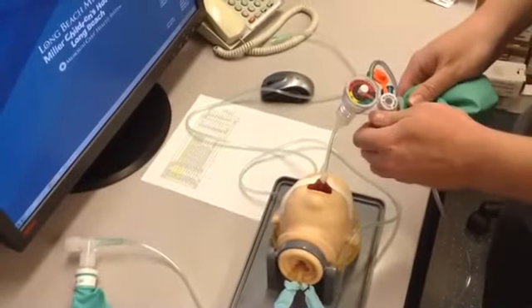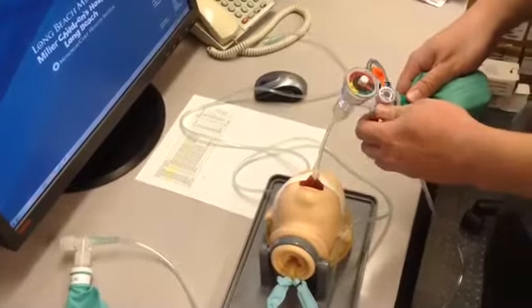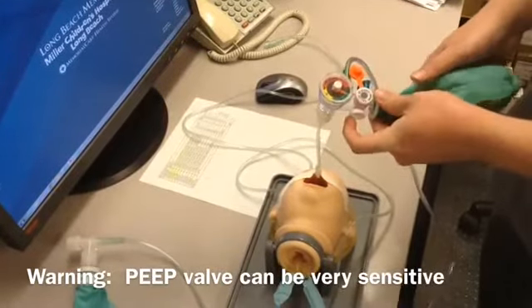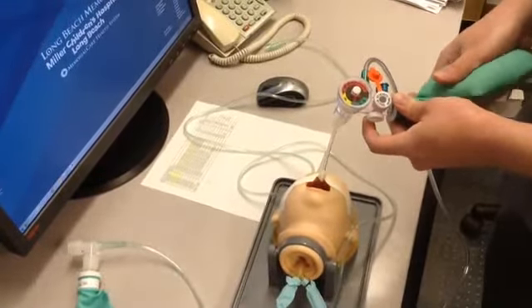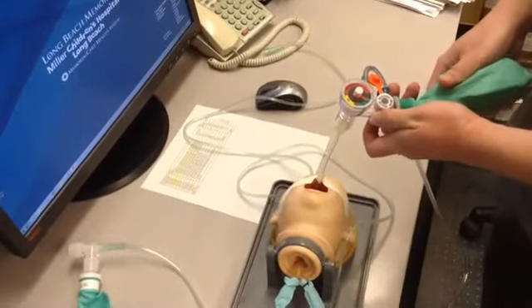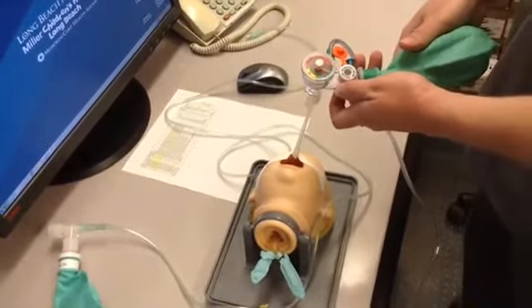So if you need to make some changes, make the changes with the pressure gauge, but be very careful, because once that valve closes so much, it can become very sensitive, and you'll run the risk of overfilling the bag and driving your pressures up. So I've had to tweak it a little bit. I've got it to where I want it, and that's basically it.